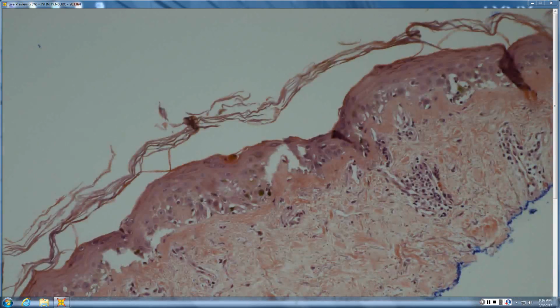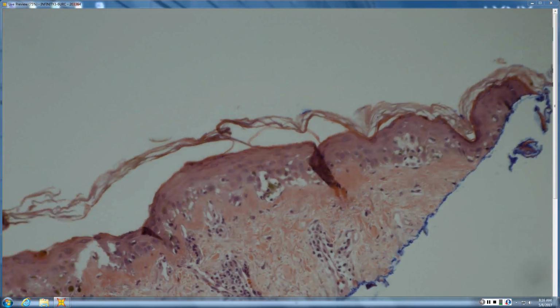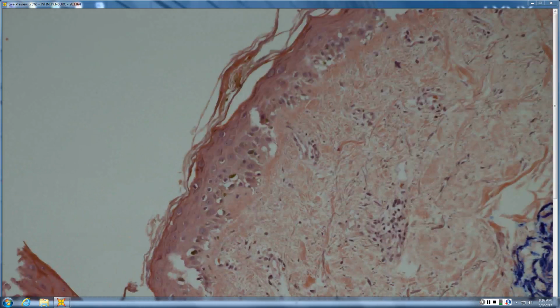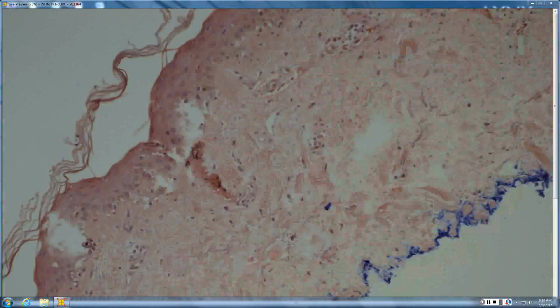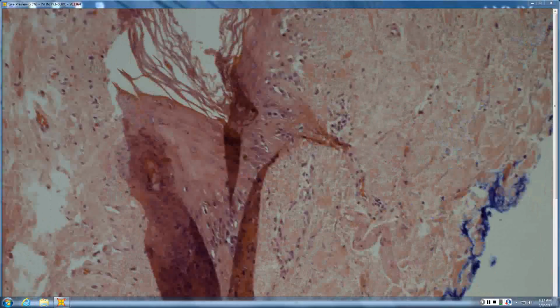So this area, boy, I'm having trouble saying whether those are melanocytes versus necrotic keratinocytes. So this is sent in by someone. I would stain it. I think that's interface. I don't think that's melanocytic. I see dead reds.